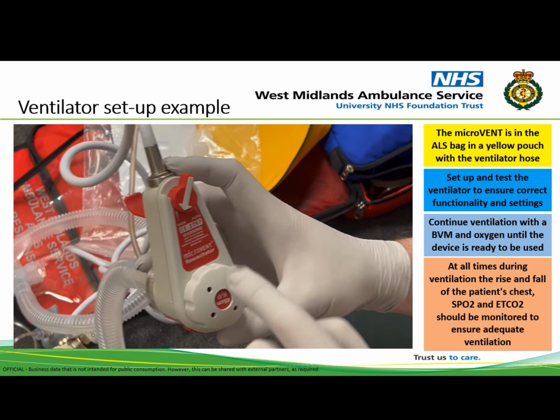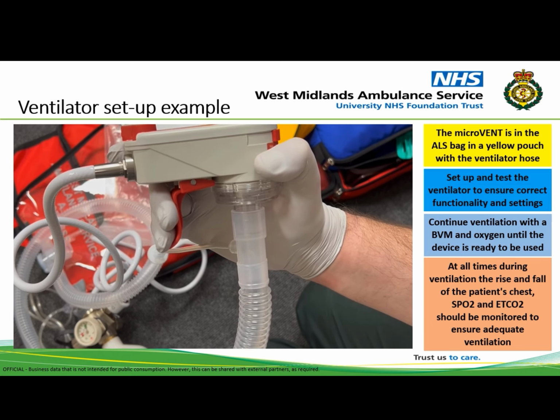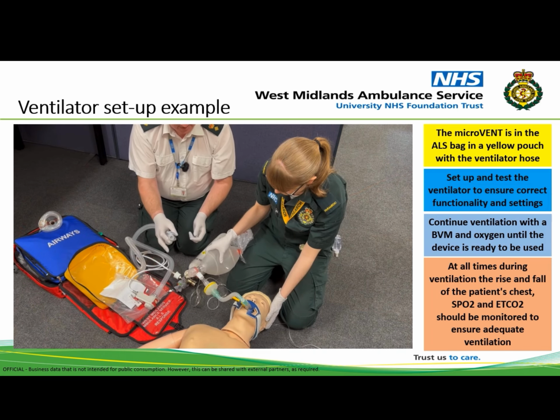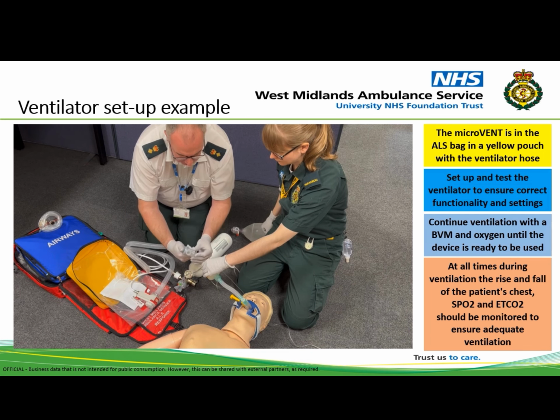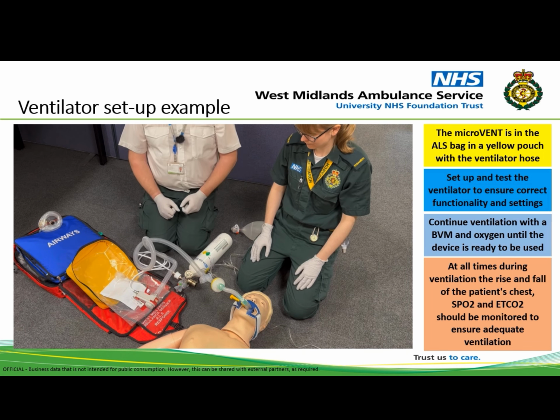Leaving the device on manual allows the trigger to be squeezed, which allows for manual ventilation. Turning the device back onto auto starts the ventilator functioning, as you can hear. Before connecting the ventilator to the patient, ensure the ventilator is switched on to auto. Connect the ventilator to the patient and ensure there is adequate rise and fall of the patient's chest. Monitor oxygen saturations and end tidal CO2, capnometry and capnography to ensure adequate ventilation.